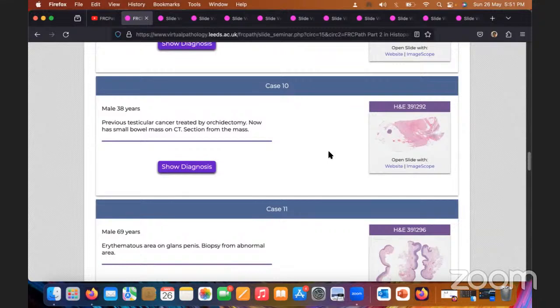Fibrocystic change, Dr. Subhasakti, I think there are elements of fibrocystic changes, but yes, you can say that adjacent breast tissue shows areas of fibrocystic changes as well as usual ductal hyperplasia. But the main lesion is obviously the duct ectasia. Okay, and there is no atypia. But you should evaluate all the sections, and you can do multiple levelings.